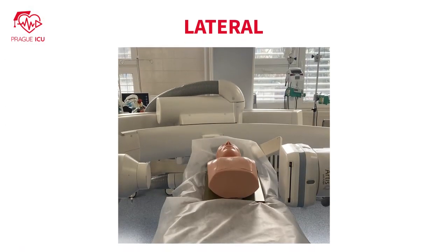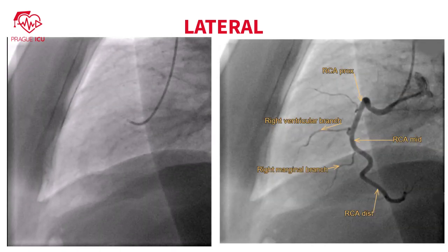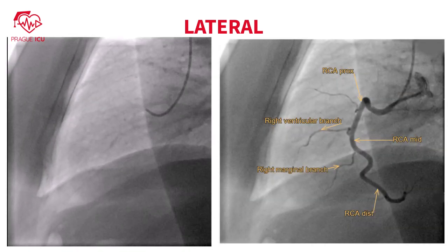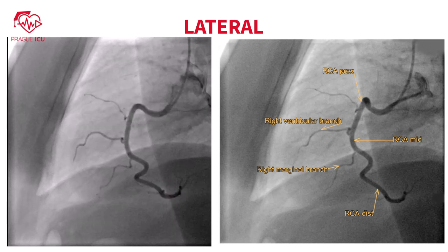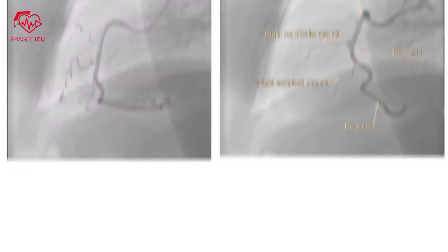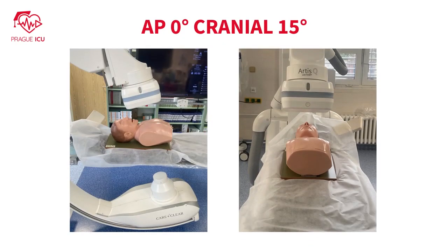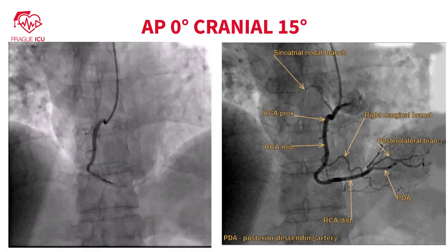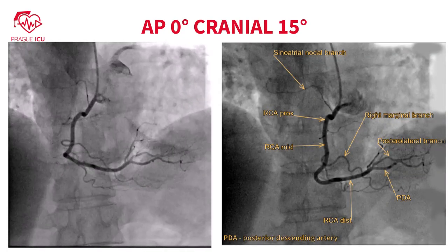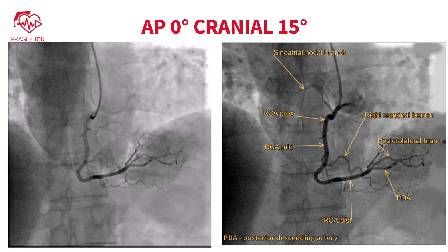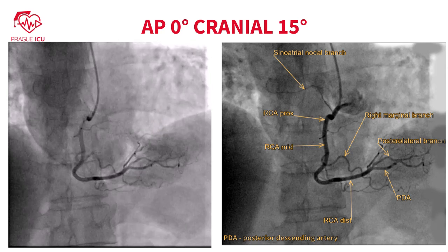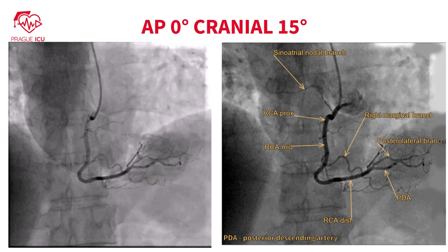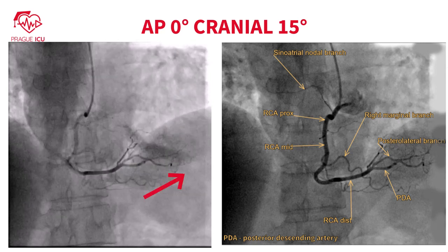Lateral, left anterior oblique 90 degrees view is the perfect view for ostial lesions and the mid parts of the RCA. AP 0 degrees cranial 15 degrees view is best for visualizing the distal RCA bifurcation and the proximal segments of the posterior descending artery and posterolateral branches. PDA directs to the apex.